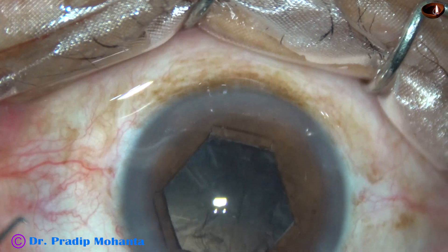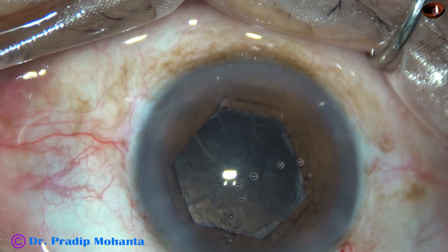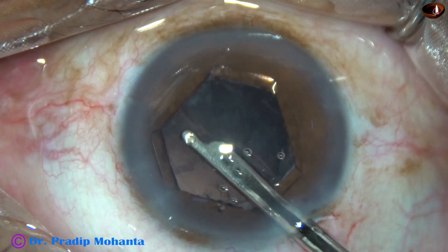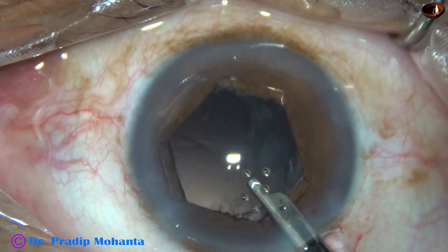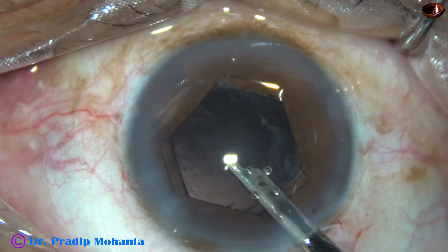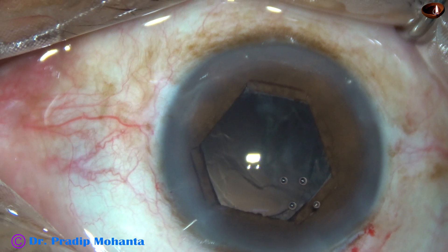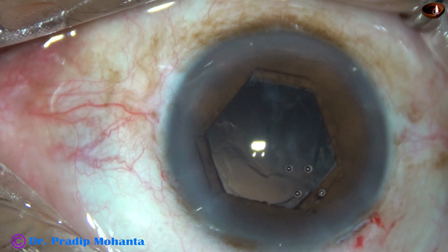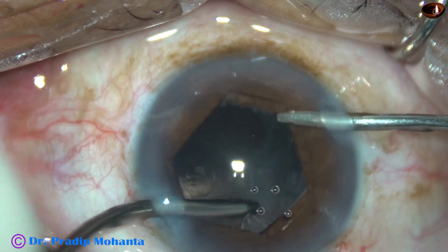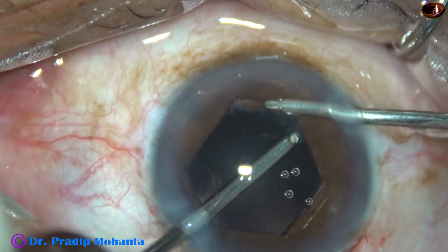Now, cortical cleanup. By the time my assistant gets ready with bimanual irrigation aspiration, I am going to remove the cortex of the left side — that is, the sub-sideport cortex — so that I don't have to change hands. It is done. Now I come out and take the bimanual irrigation aspiration. Irrigation goes through the right sideport and the aspiration cannula from the left sideport. I aspirate the rest of the cortex. Cortical cleanup is done nicely.